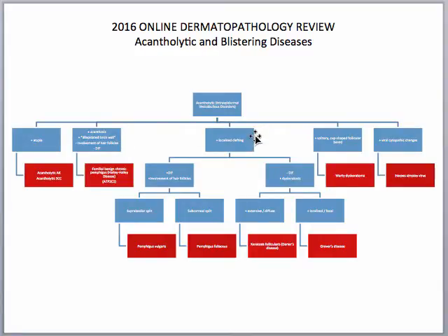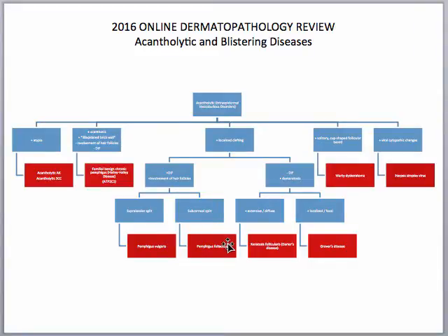If the acantholysis seems to be localized to one specific layer of the epidermis, then you want to take a closer look. If you have involvement of the hair follicles or positive direct immunofluorescence in a net-like pattern with C3 or IgG and a suprabasilar split, you would want to think of pemphigus vulgaris. A subcorneal split — you would want to think of pemphigus foliaceus.